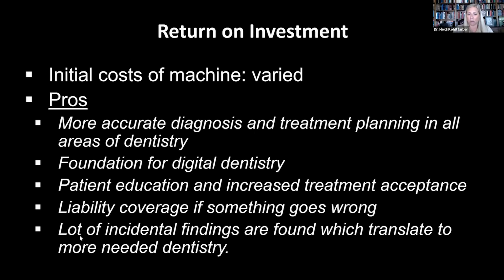And what are some of our pros and cons with having a CBCT? Well, more accurate diagnosis and treatment planning in all areas of dentistry. It really becomes the foundation for digital dentistry.